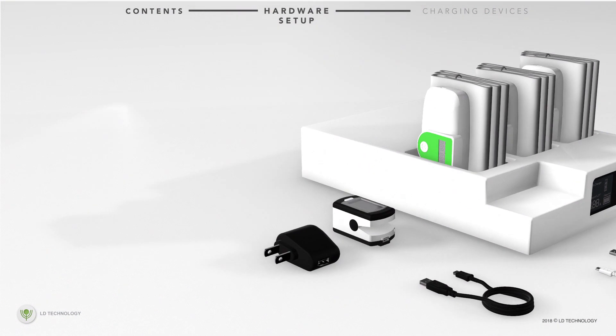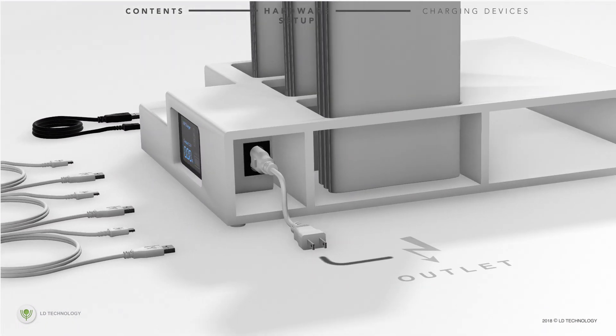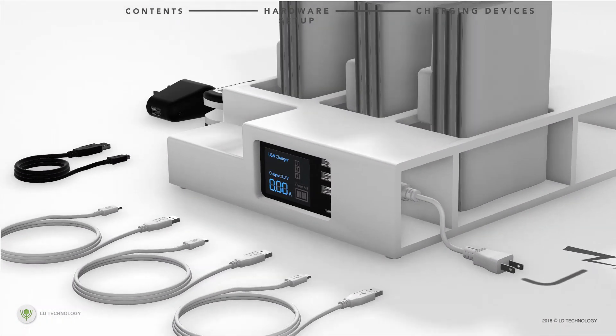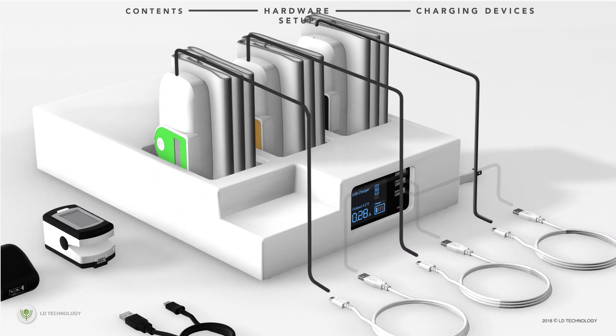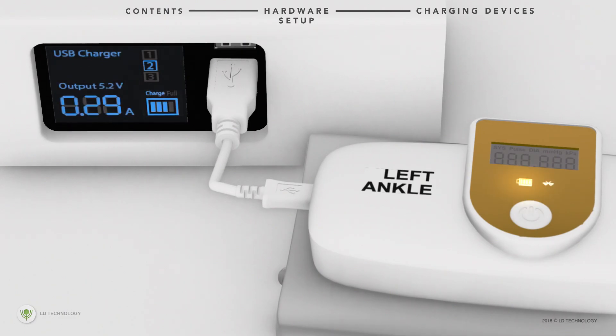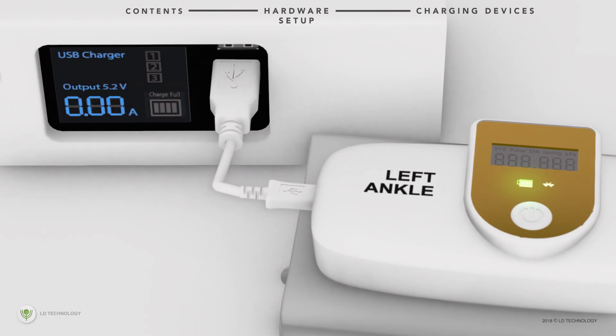To charge the Bluetooth and wireless devices, connect the charging dock power cord to the electrical outlet. Next, connect the three USB charging cables to the charging dock port and Bluetooth blood pressure port. When charging, the USB dock displays values. If it displays zero, that means the device is fully charged, and the Bluetooth blood pressure battery indicator is green.